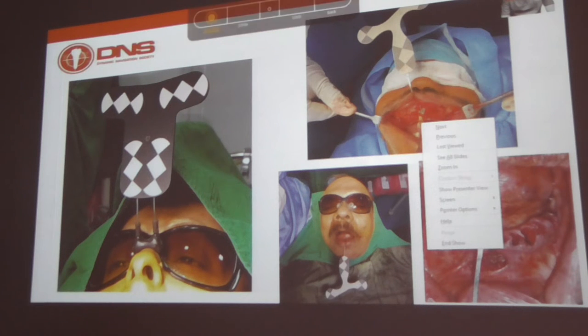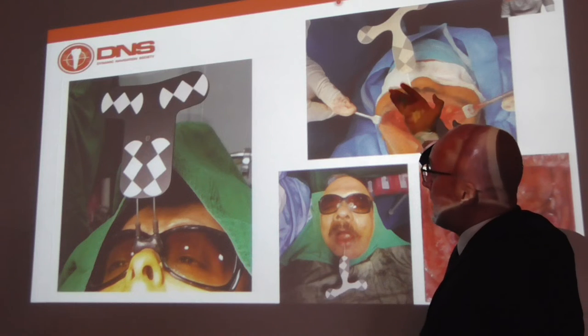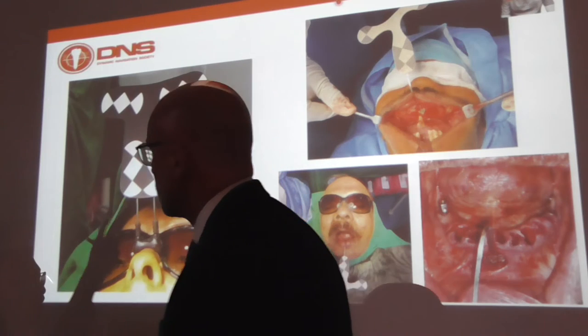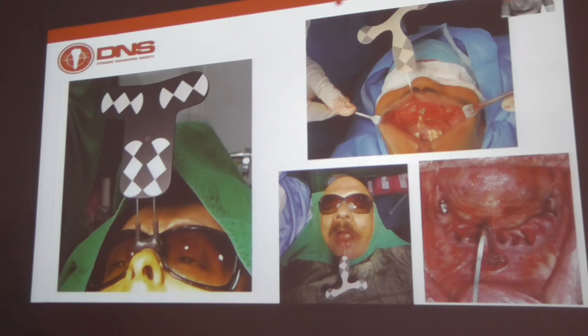Excuse me. Yes. Just a question. I think this is an important point that we have to say. This part here, because if you have a tension of the lip, it can bend this. No. So this is a better way of doing it. Yes. I make it into an S shape. Yes. But it's something that you have to be careful of. Yes, the lip has to be passive. Otherwise, the lip will have a mark at the end of the surgery. I use the Optragate, which can lift the lip in order not to touch it. I agree with you, but it's a little more finicky for sterilization, so I don't use Optragate all the time. Okay.